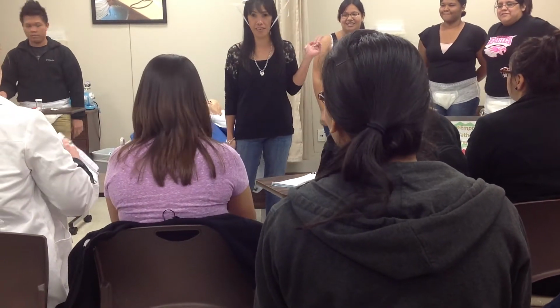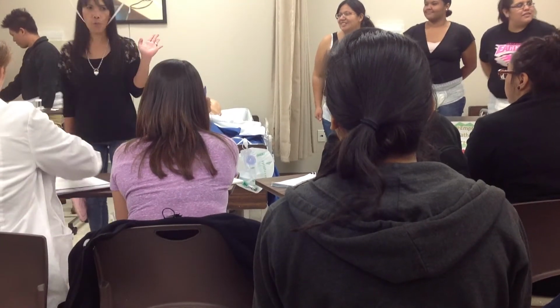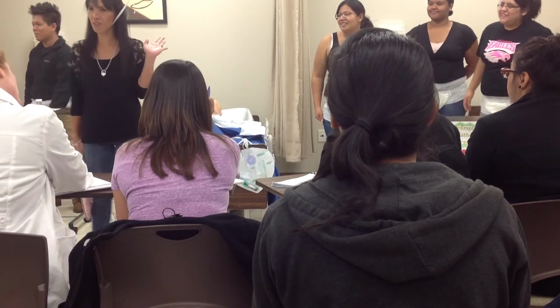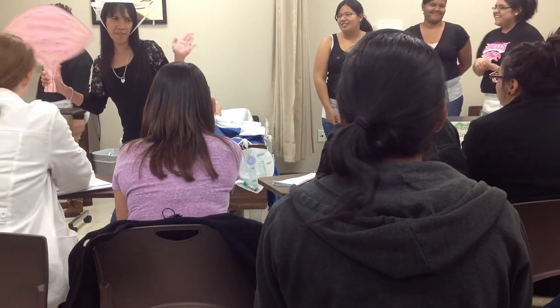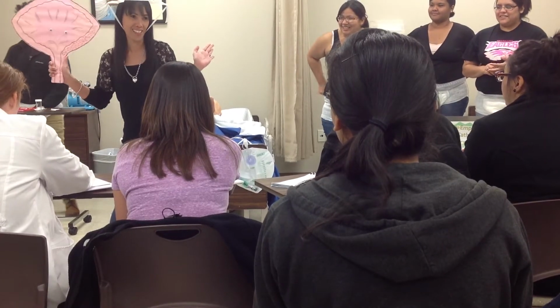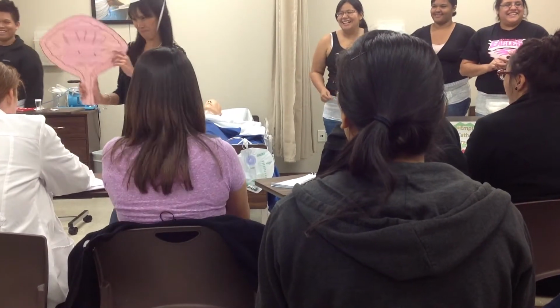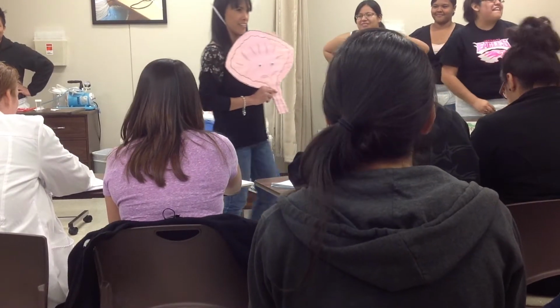Demonstrating to you guys the urinary elimination. And we have a surprise for you. We have a friend coming to us and saying, "Hi, my name is Bladder, and I am sterile, so better keep me sterile." That's the message. So you learn now how to keep this guy sterile.